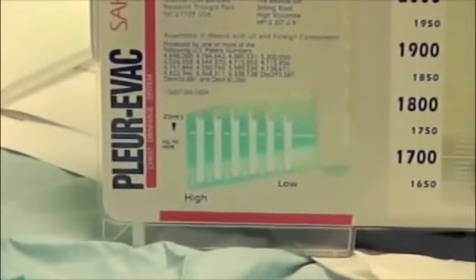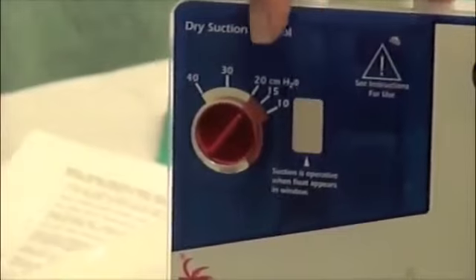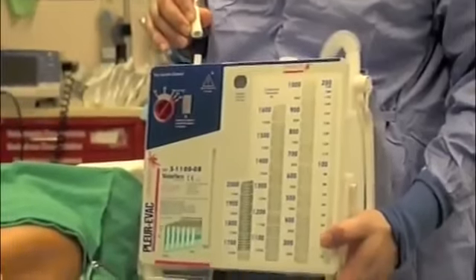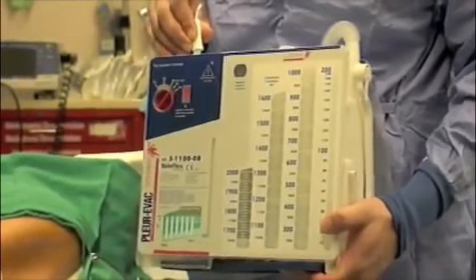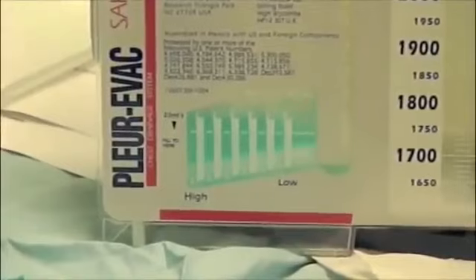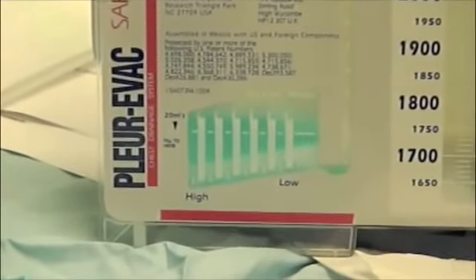Ask the patient to cough and observe for bubbles in the Pleurovac. Set the suction to minus 20 centimeters of water. You should observe the orange float rising once the wall suction is applied. Bubbles will appear in the air leak meter if there is an air leak or if patient coughs.